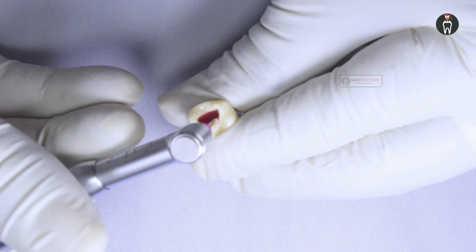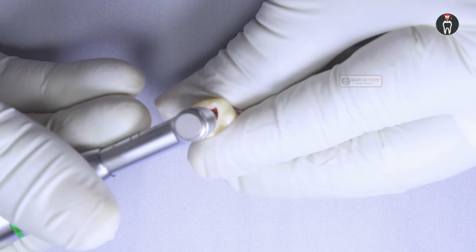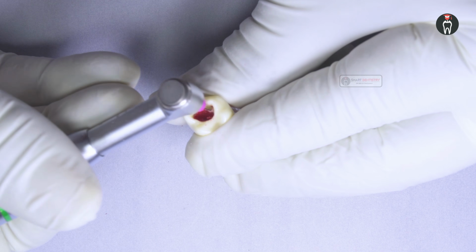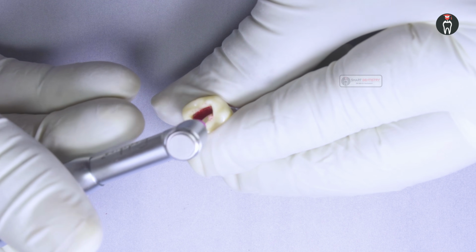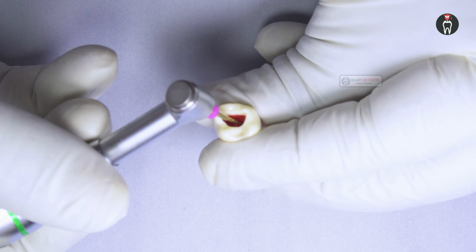The advantage of the brushing motion is it enlarges the coronal part of the canal wider, so that the file will not make contact with the coronal portion, and the chances for screw-in are reduced.